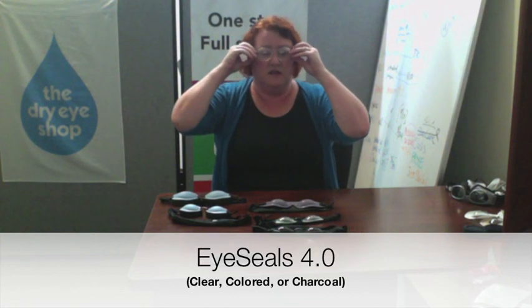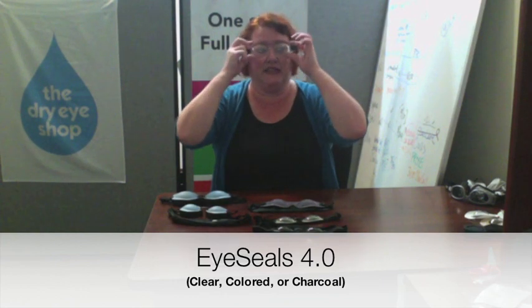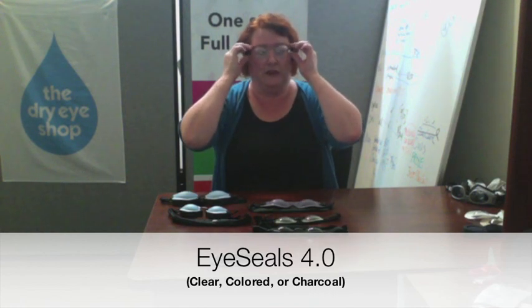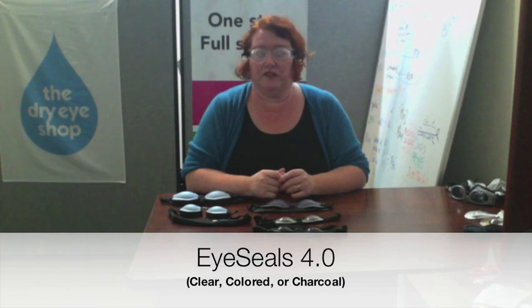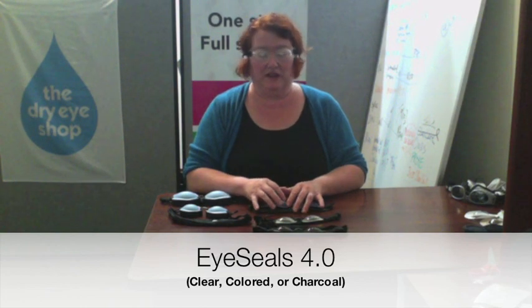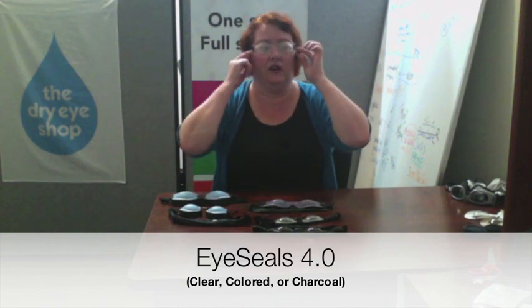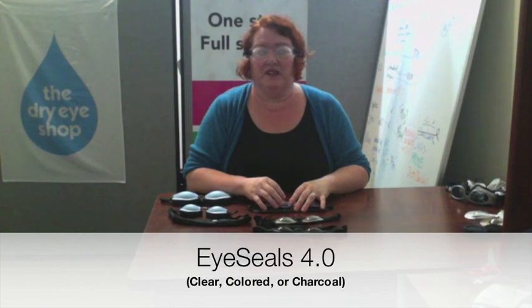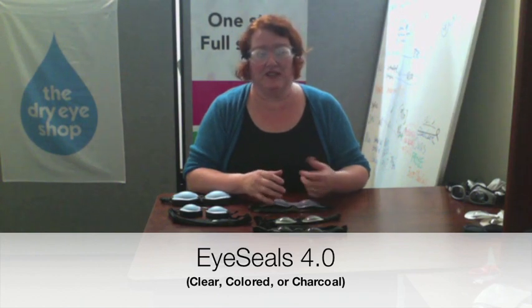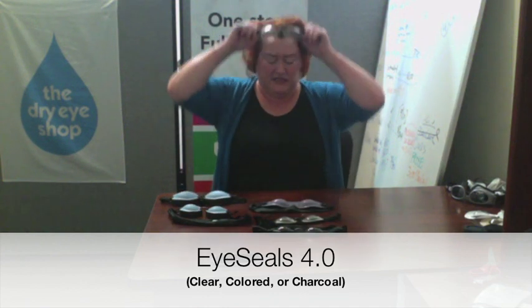Here's the clear one. The claim to fame with the Eyeseals is the flange. It's just got a lot of skin contact with the flat thermoplastic all the way around. So you really get sealed in well. It's also a larger fit, so this tends to be more men friendly than the other ones. That's not to say it isn't women friendly. Just ladies with really small or really narrow faces, you may find you get some gapping either here or at the sides. So again, experimenting with fit is a really good idea. Even though it may get a little expensive initially, I tend to encourage people to buy a couple things and then send back whatever doesn't fit. So that's the clear one.